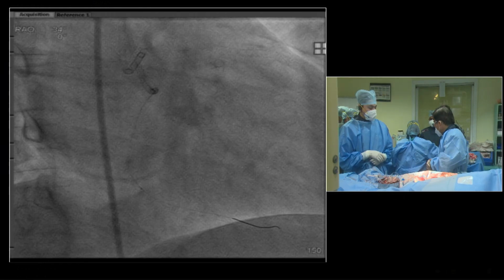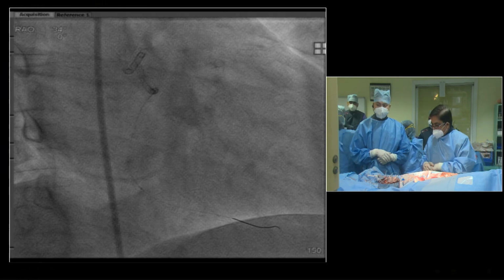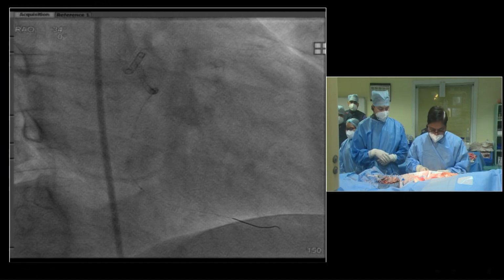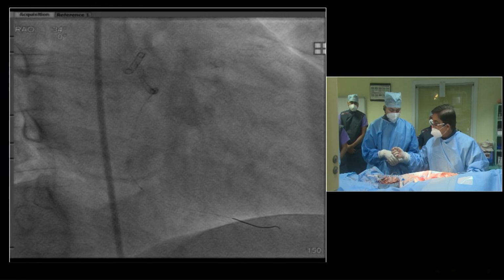This angiogram you don't know. Goel sir, before itself I told Dilip, you don't know. Dr. Goel will cross antegrade and will show the technique also. Yes, and I was telling him beforehand. Now he is telling correctly. I predicted.